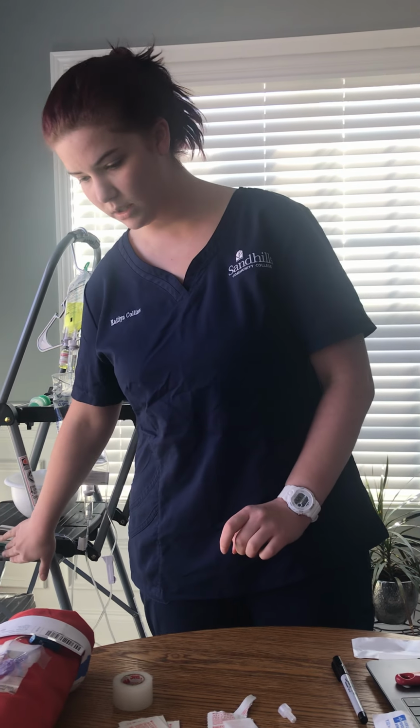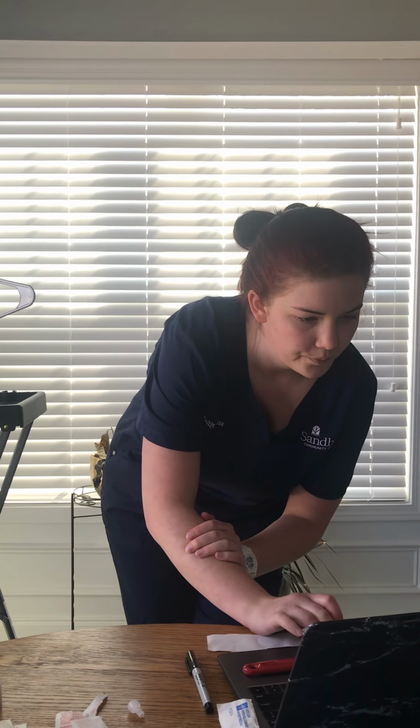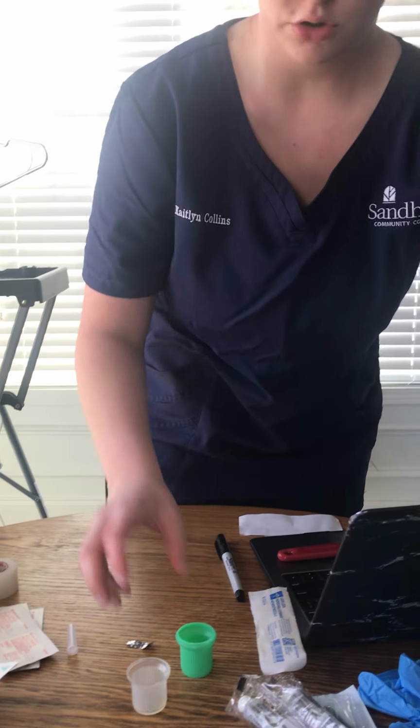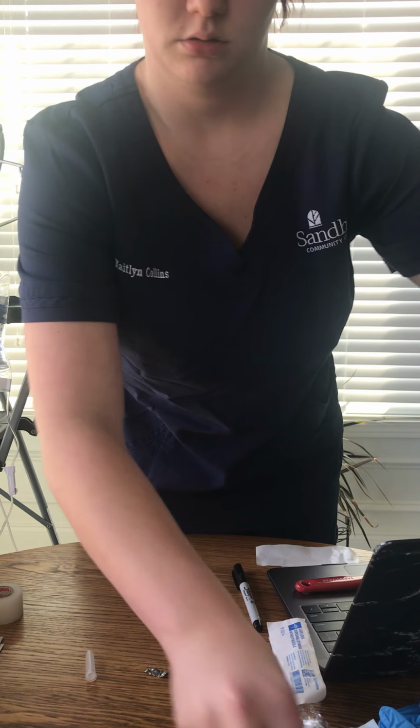I'm going to start this pump, and I'm going to gather my supplies to get my other medications ready after I document the administration of this medication. So I've done all of that. And we are now going to start the administration of the lorazepam push. So let me get my supplies together. Everything right here.